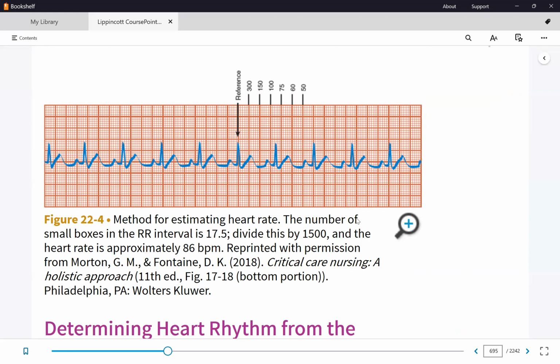You notice this sample? See, this is what I mean by the waves and complexes never fall on a solid line. So you can just estimate an isoelectric line. We saw that, we call that isoelectric, meaning a flat, straight line. So for this example, where can you put the isoelectric line? Somewhere here, right? So somewhere here is where each wave and complex leaves and returns. Okay. So let's go back here.